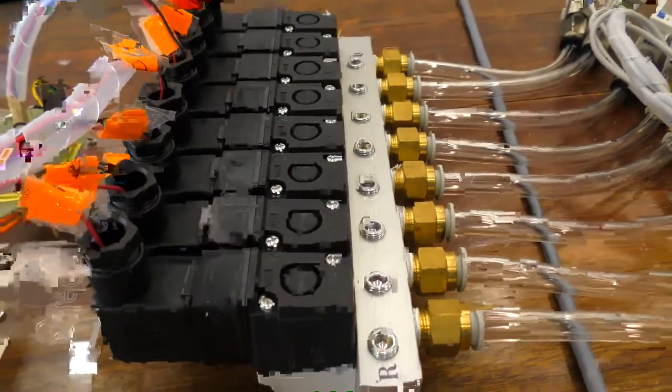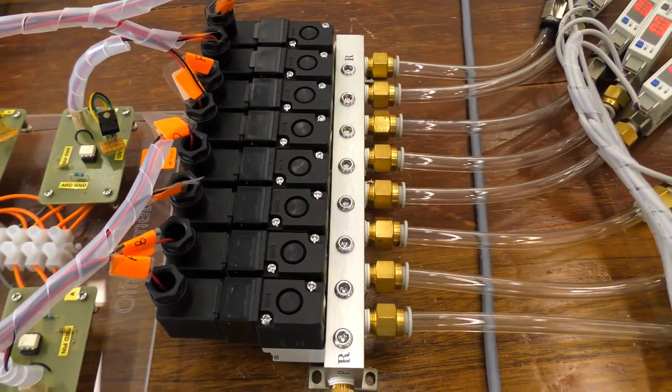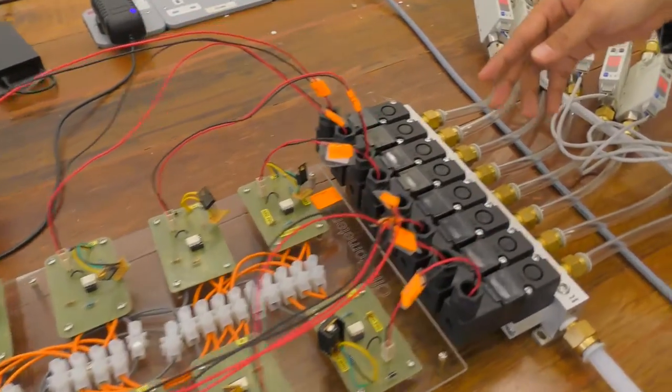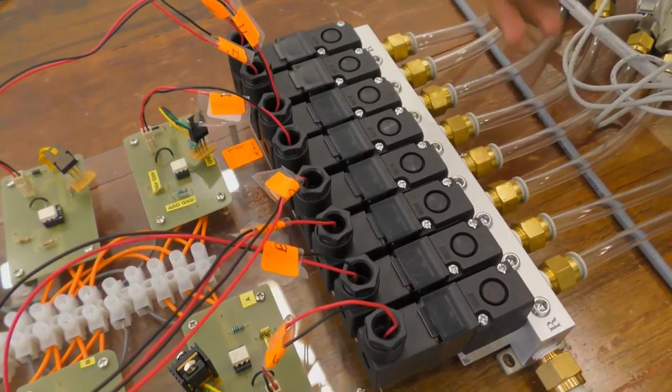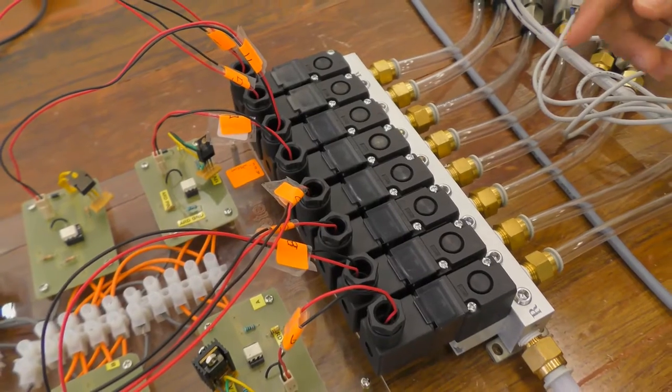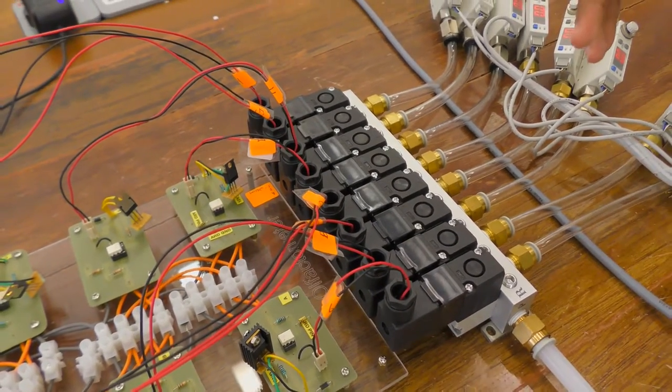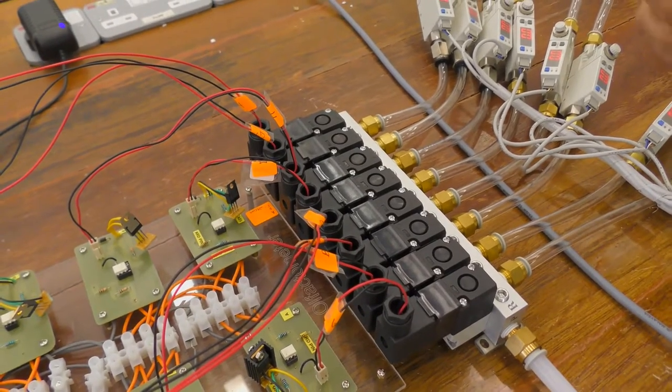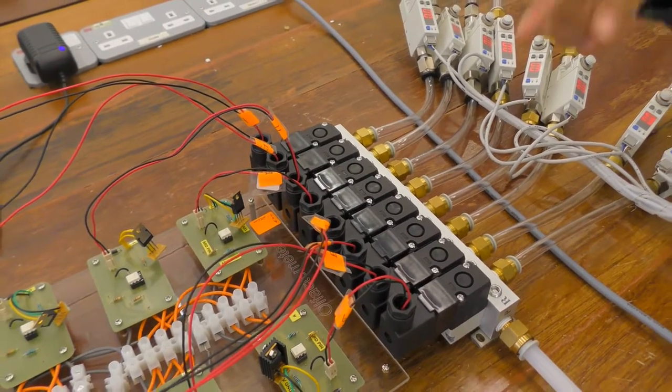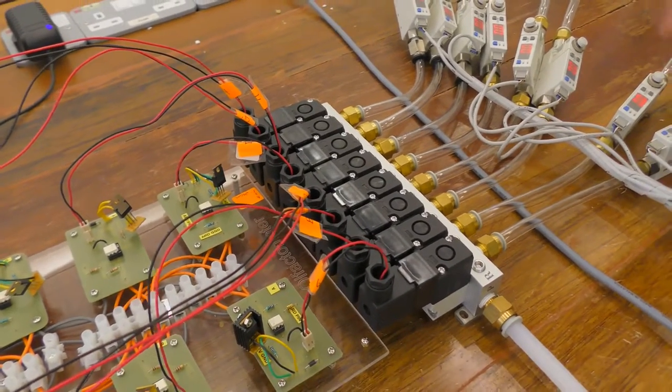After that, the air will go to the solenoid and manifold. Solenoid is a valve which contains eight valves which are connected to the circuit which is controlled by the Arduino program. From the Arduino program, it will make sure that the circuit is switched on or off according to the system programming.